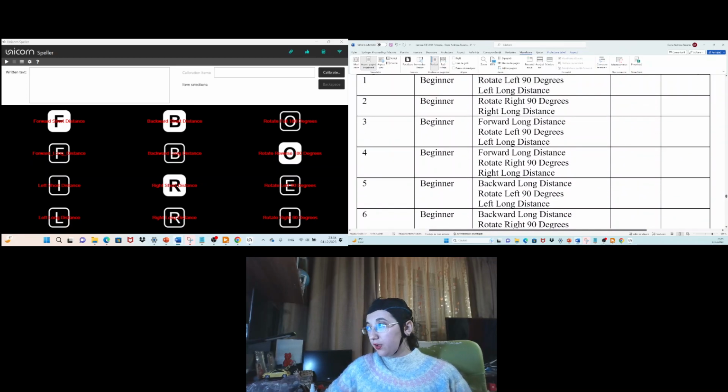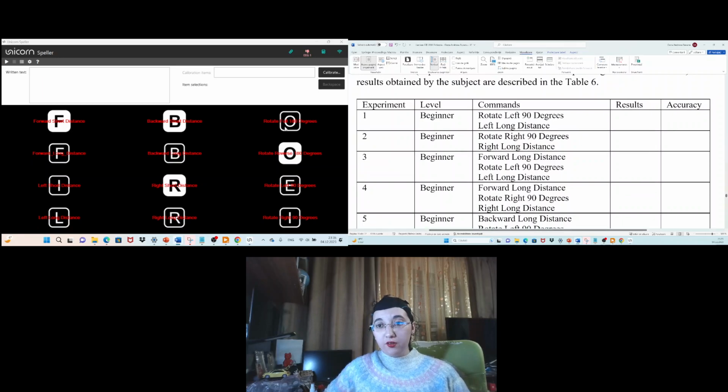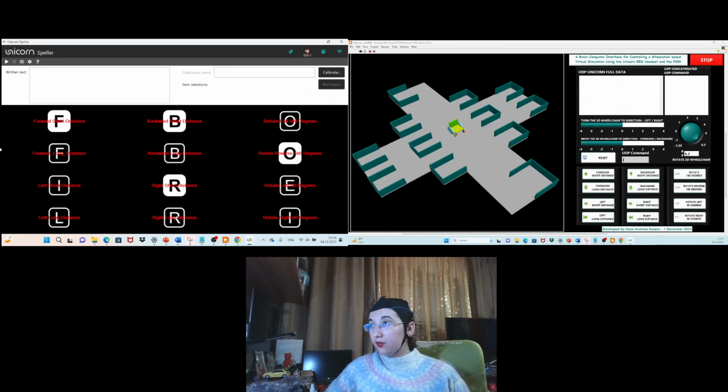So we have rotate left 90 degrees. Let's see the command. Rotate left, this one, 90 degrees, and then left long distance, this one. So, rotate left 90 degrees and left long distance. Let's begin. I will focus my attention on this character. This one and then this one.